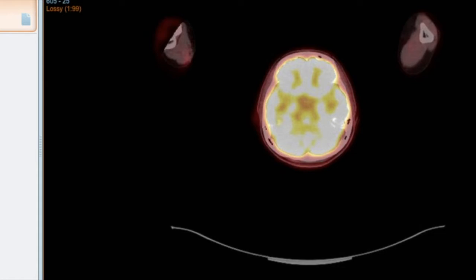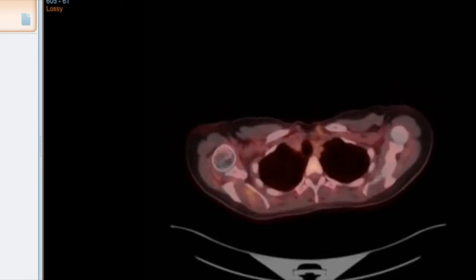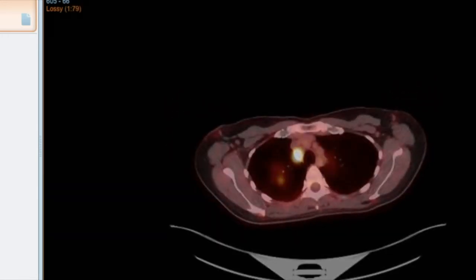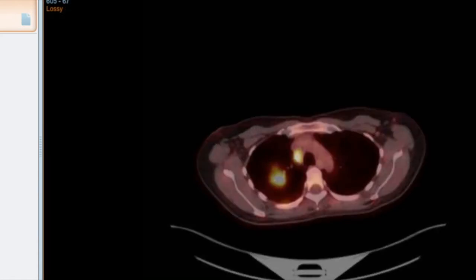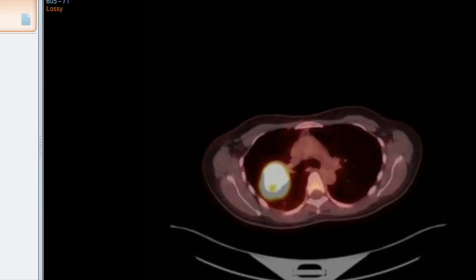Now we've got the PET scan here, and if we just scroll through the PET scan, you can see that this superior right paratracheal lymph node is intensely FDG avid. It certainly looks like a lymph node metastasis.